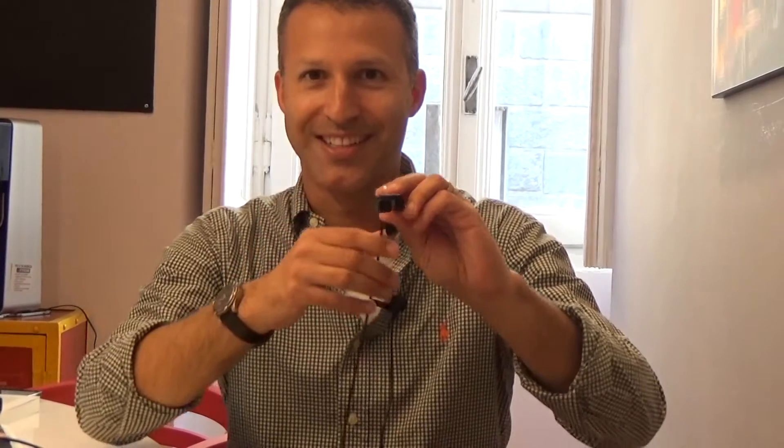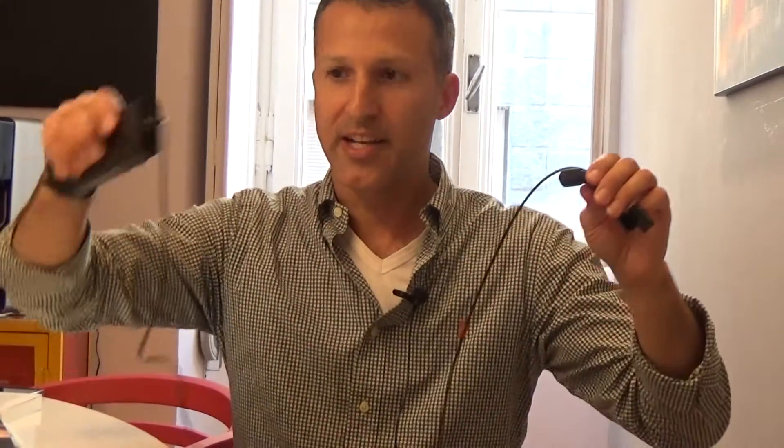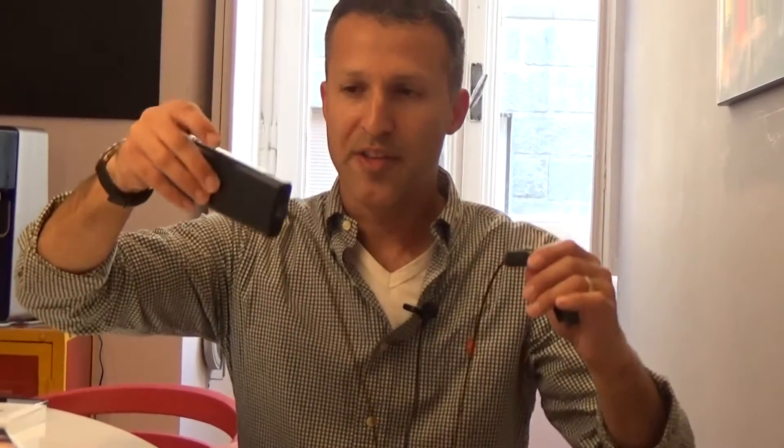I'm going to show you the device and show you exactly how it works. This is the head unit of OrCam MyEye, with a small camera in front and a speaker for audio in back. It is connected to this base unit, which is about the size and weight of a smartphone.